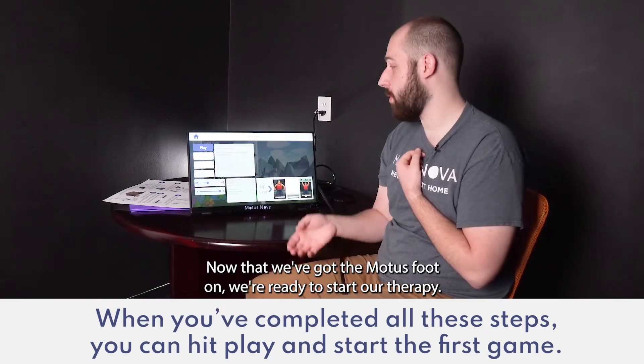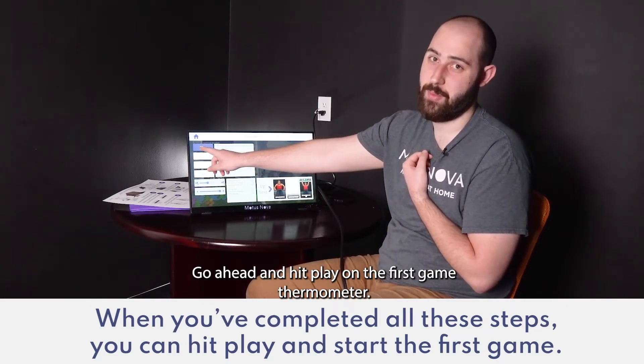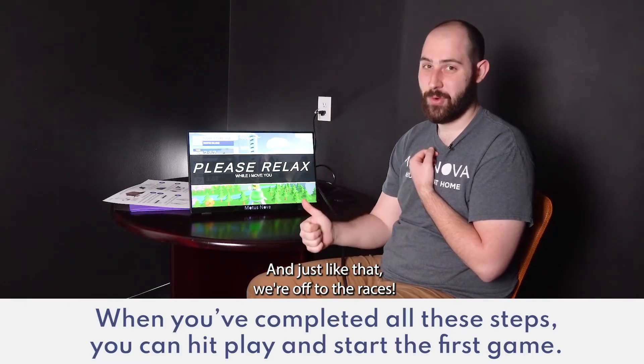Now that we've got the Modus Foot on, we're ready to start our therapy. Go ahead and hit play on the first game, Thermometer. And just like that, we're off to the races.